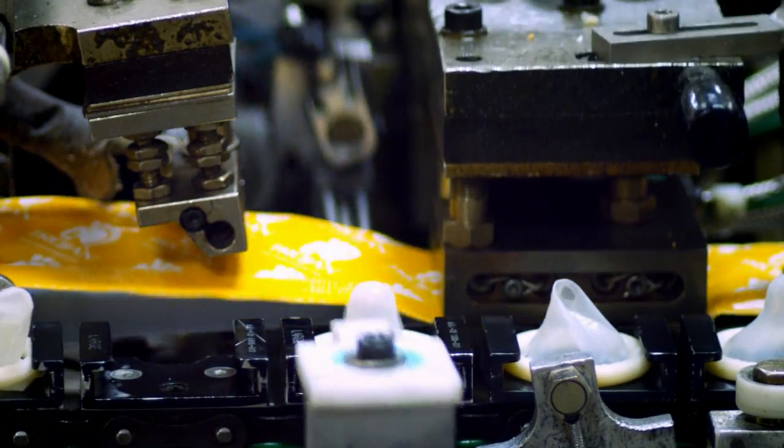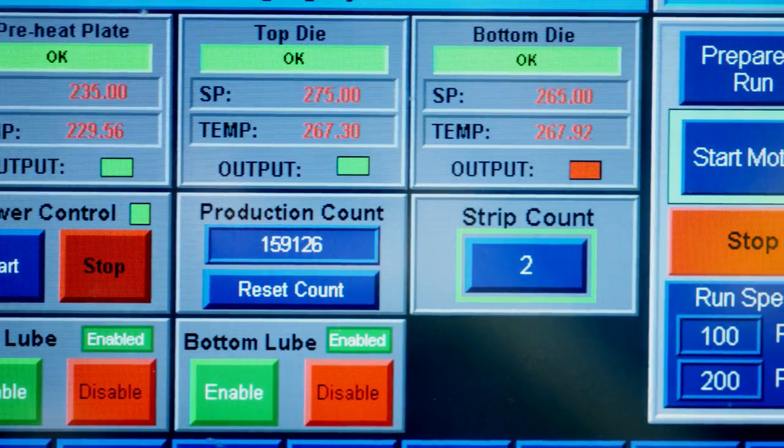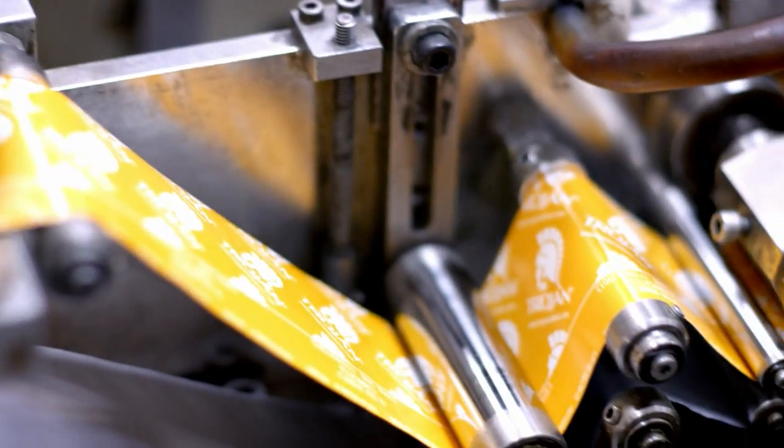Here, the condoms are placed in their final protective wrapper. These machines both electronically test and then wrap each condom. As the condoms are wrapped, they're simultaneously injected with a lubricant to maximize performance, protection, and pleasure.